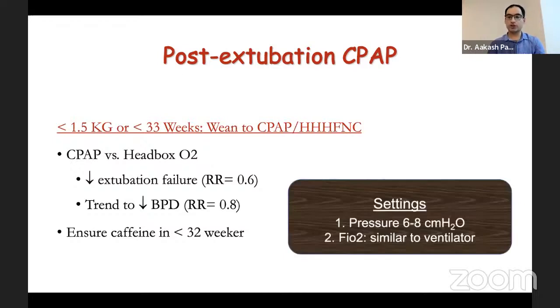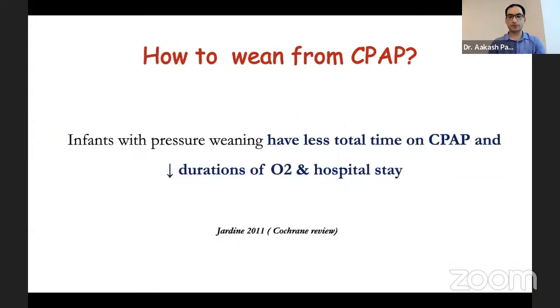And post-extubation, we use slightly higher pressures of 6 to 8 centimeters of water. More premature babies use higher pressures. And FiO2 is similar to the ventilator. That is, during weaning, whatever the FiO2 is on the ventilator, start with the same FiO2 on CPAP.